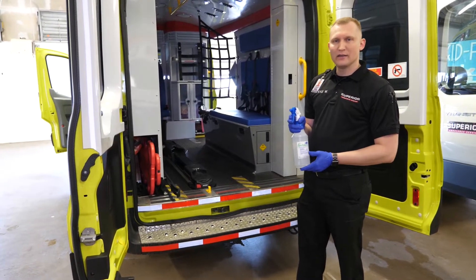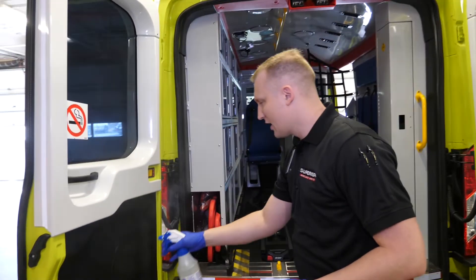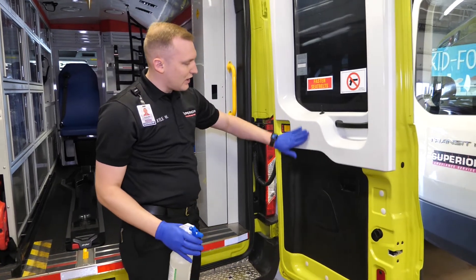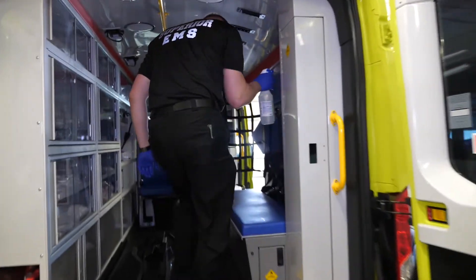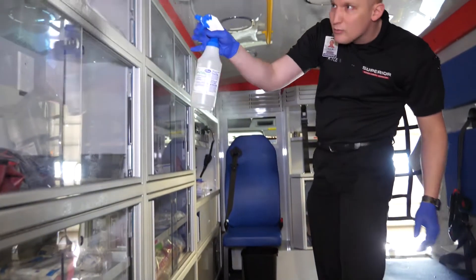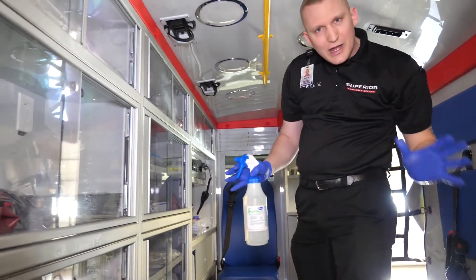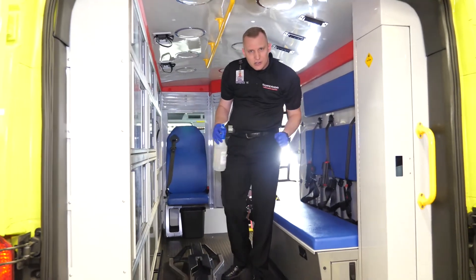Once done with the front, we move to the back of the ambulance — same process. We take the manual sprayer and spray the solution over the entire back of the ambulance, making sure that we get all surfaces wet. We want that to stay wet for two minutes for the decontamination process to occur. We work our way through the entire ambulance — making sure we get our ceiling, making sure we get our floors — then allow this to air dry. Once the air dry is done, your decontamination process is done.